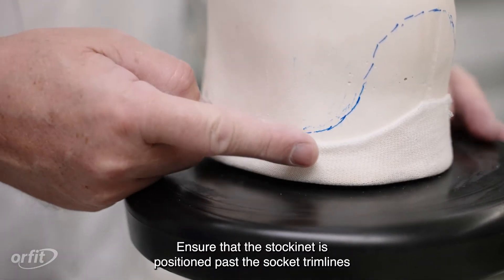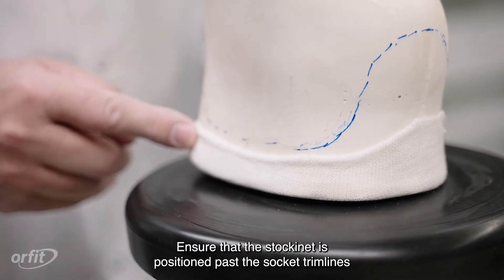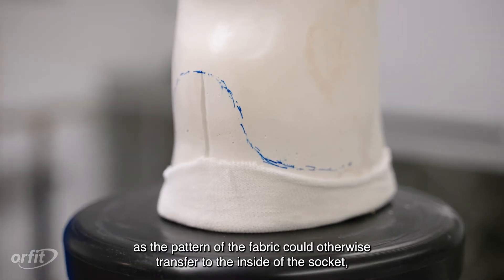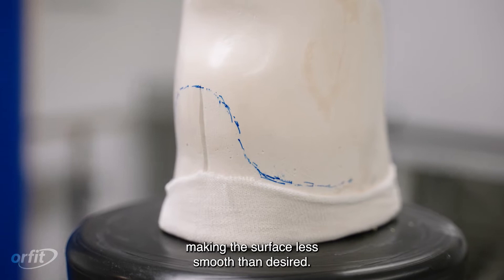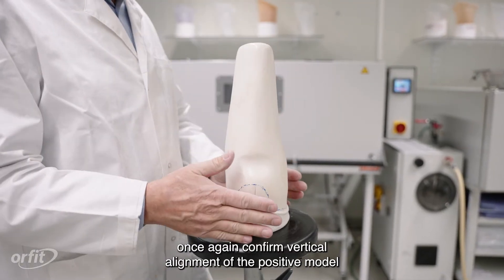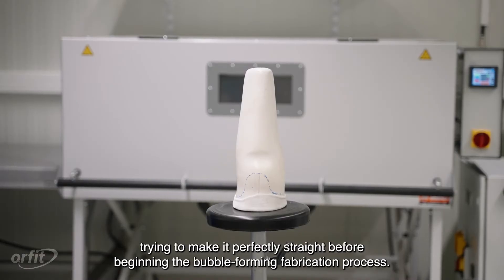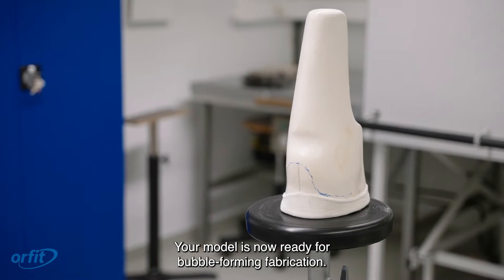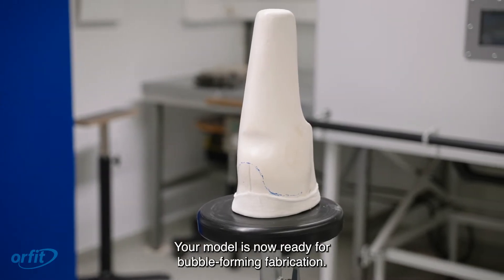Ensure that the stockinette is positioned past the socket trim lines, as the pattern of the fabric could otherwise transfer to the inside of the socket, making the surface less smooth than desired. When this stage is completed, once again confirm vertical alignment of the positive model, trying to make it perfectly straight before beginning the bubble-forming fabrication process. Your model is now ready for bubble-forming fabrication.